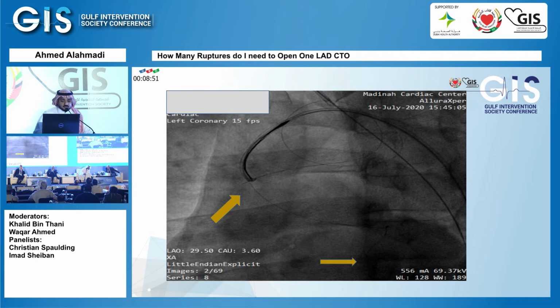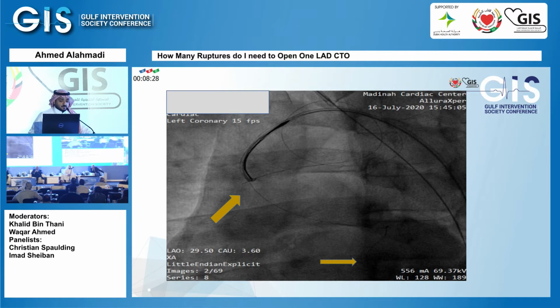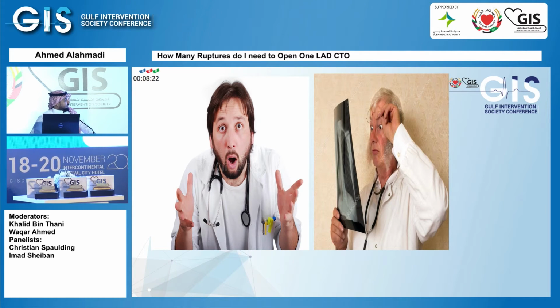These are the two catheters here, because we didn't take this picture, but you see here, this is a loop of the guide wire in the ascending aorta. There are two ends, one end is here, and the other one is in the diagonal. So this is me when I saw that picture, because it's the first time I saw something like that. For 10 seconds, I'm thinking, what is that?